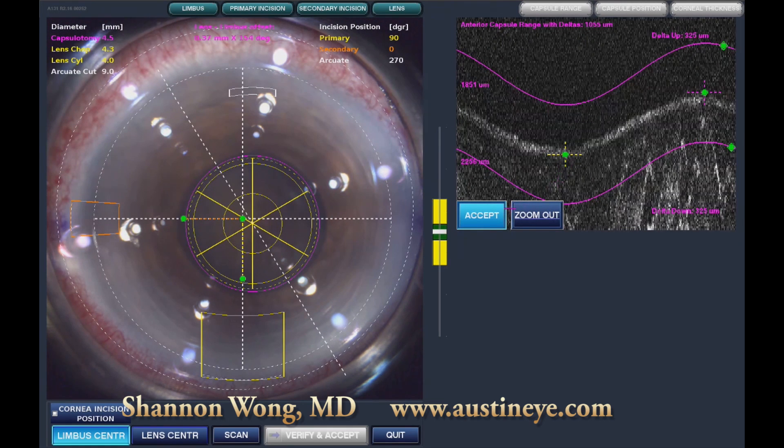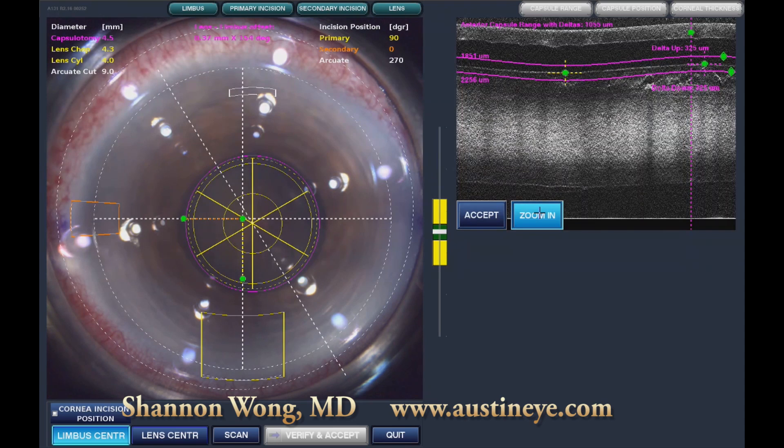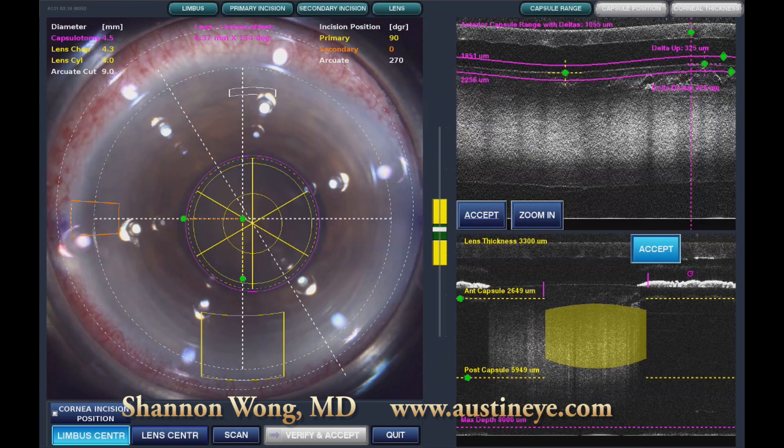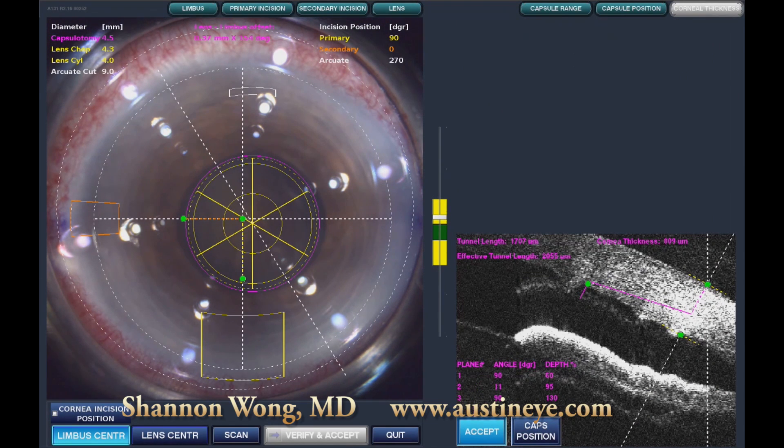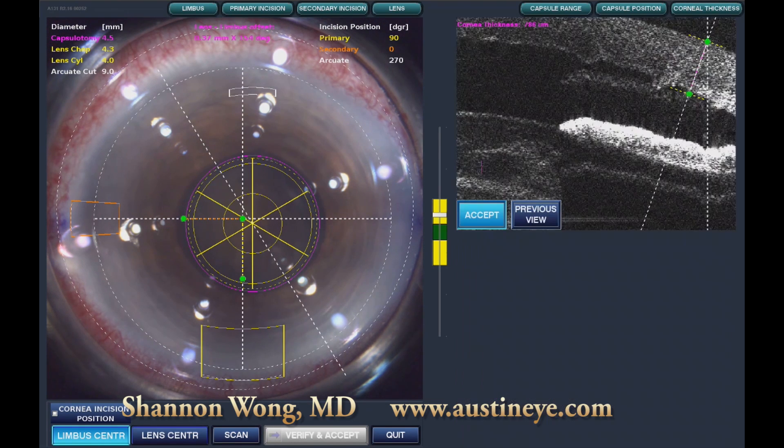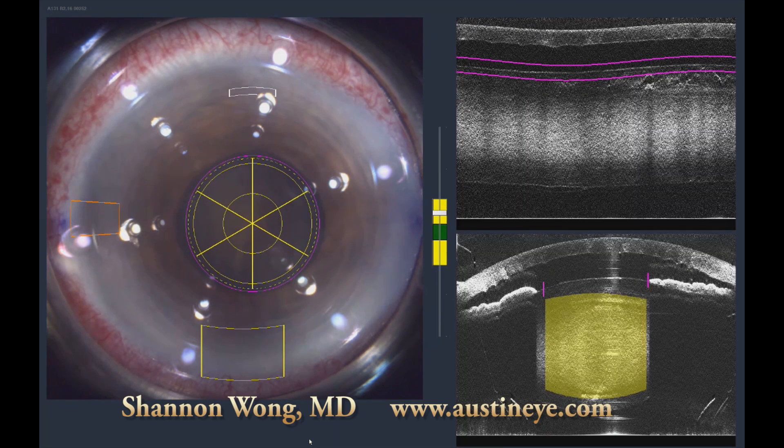This was to date the most brunescent lens that I had used the LensX laser on. Here I am adjusting the capsulotomy, and then we image the lens itself — you can see the lens thickness is over 5 millimeters. Our usual lens thickness is in the 3 millimeter range. This lens was 60% bigger than average, and you can see the crowding of the angle that resulted from the increased lens mass.